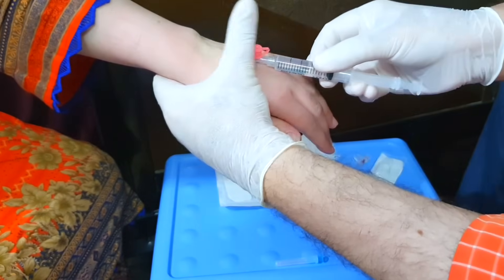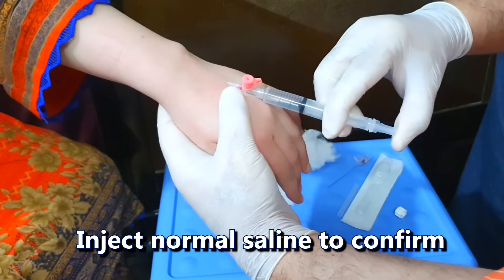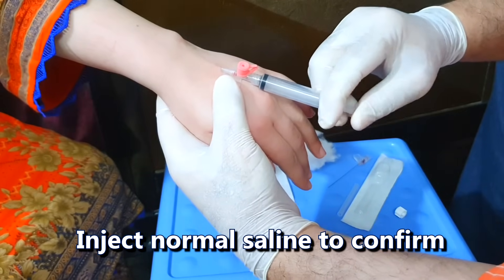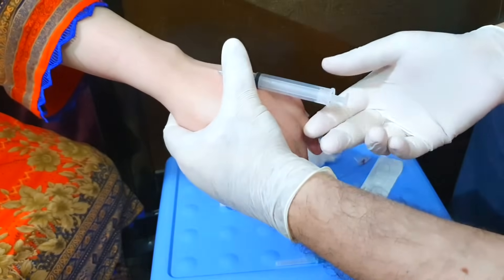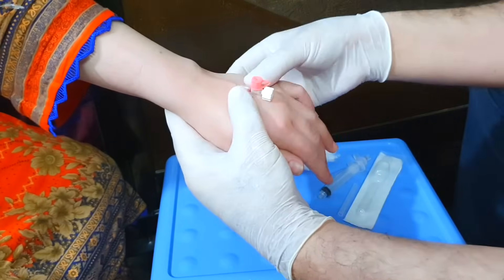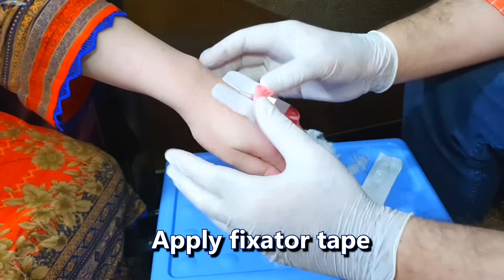You can confirm that the cannula is properly placed inside the vein by injecting 5 ml of normal saline into the cannula. As you can see, injection of normal saline has not caused any swelling around the cannula — this confirms that the cannula is properly placed inside the vein and there is no double prick. Apply fixator tape so that the cannula is fixed in its place and does not come out accidentally.